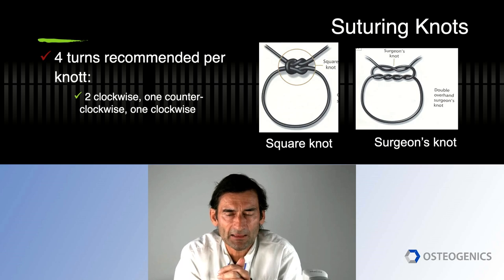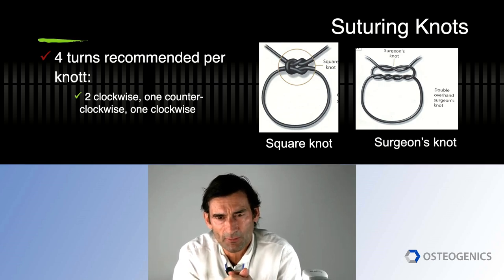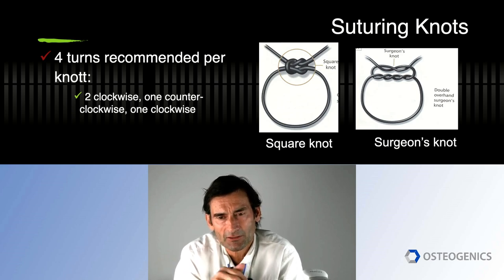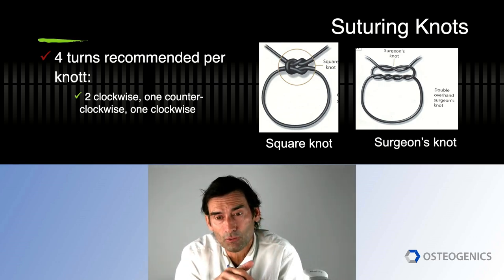And I think that in the community, the two-knot type of history really comes just from the old days when silk sutures were being used, which we don't use today anymore. You lock them, they're locked, but they're very difficult to manage. Nylon, I do the same thing, four knots. It's really like four turns, really recommended to have no loosening.